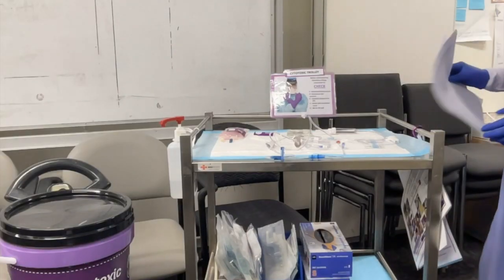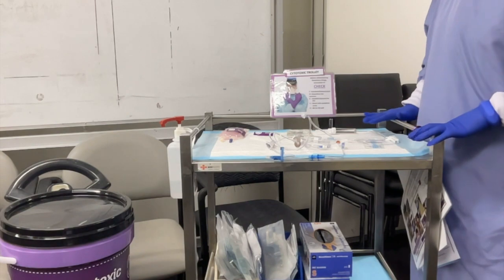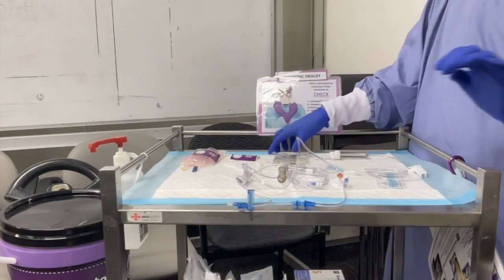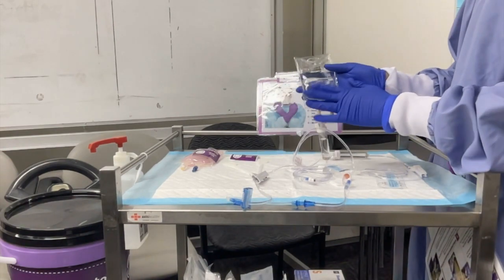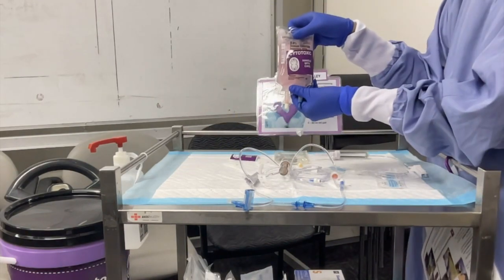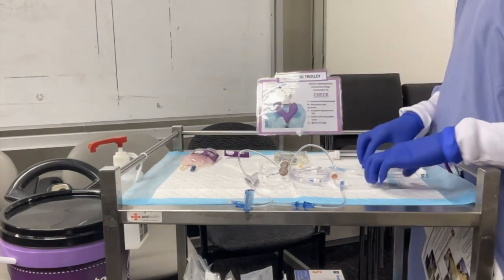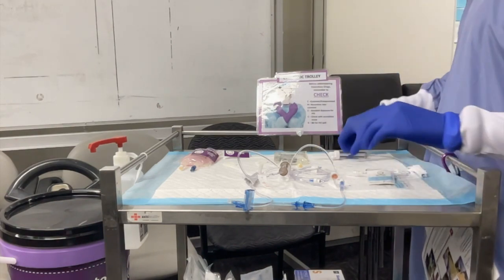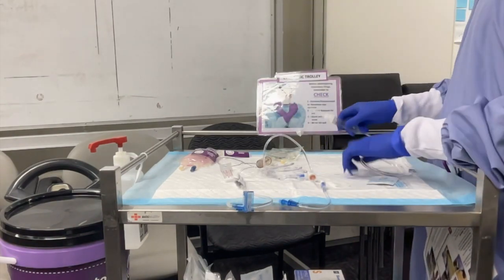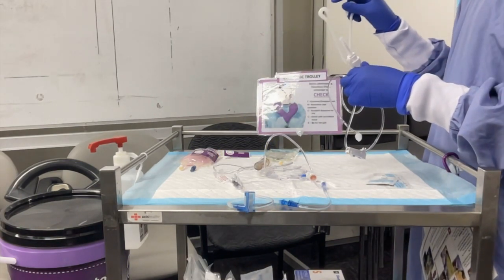All right, guys, for this practice, we need to have the correct PPE on first, and this is our cytotoxic trolley. I wanted to run through with you what is actually in the cytotoxic trolley. First of all, we have the fluid maintenance that is compatible with the cytotoxic medication. It could be glucose or just normal sodium chloride. We have the cytotoxic medication. We have extra labels to label what is cytotoxic. We have the alcohol swabs in here. And the most important thing, we have the primary line, okay? We also have a secondary line that always comes with a hanger to help us hang the medication and also the fluid maintenance.